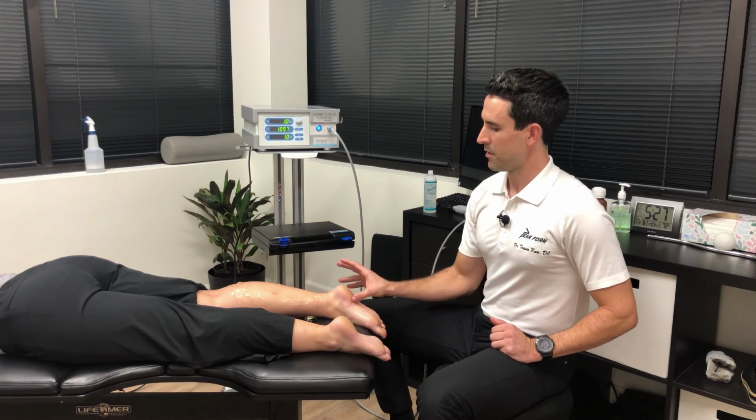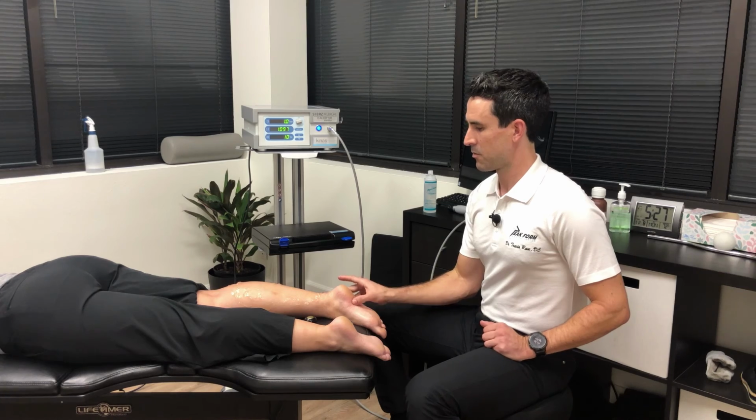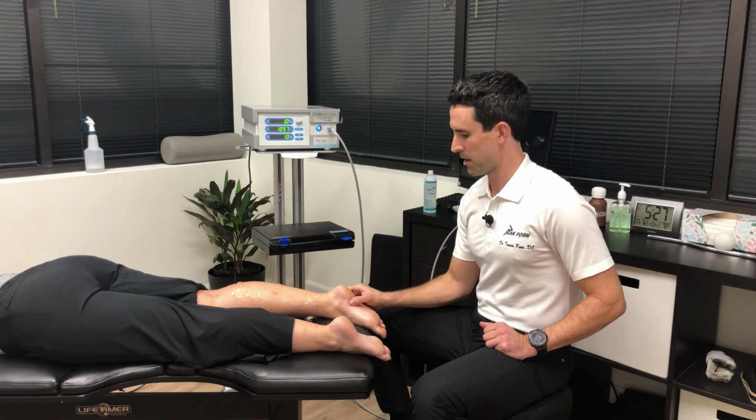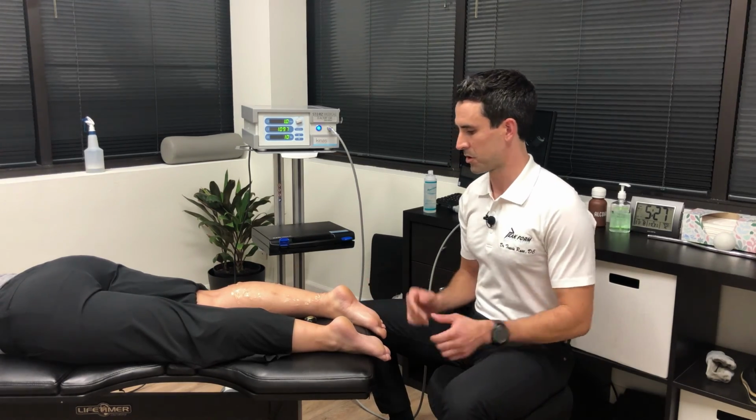And then if there are still some symptoms that remain after that period, we do a re-exam and we see if we need to do another set of treatments depending on where the patient's at that time. But that is, like I said, the typical treatment that we'll do using shockwave therapy.